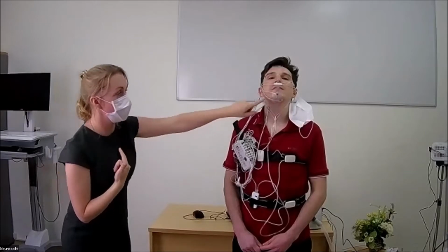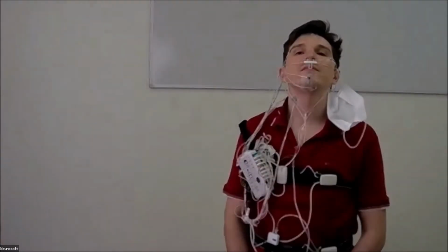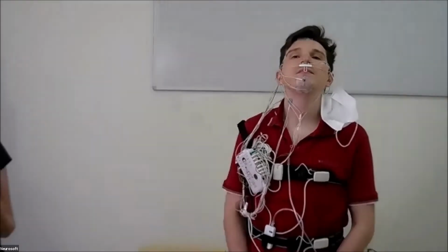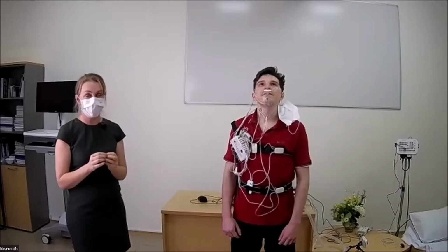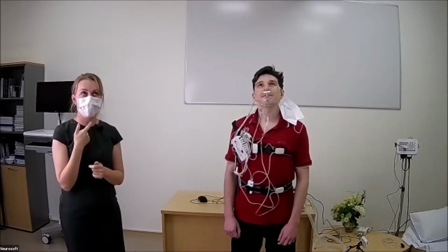So we have 3 electrodes, which allows us to create 3 bipolar derivations. But for sleep staging, we need 1 derivation, which consists of the electrodes put above the mandible and below the mandible.